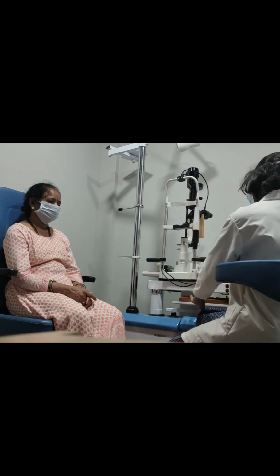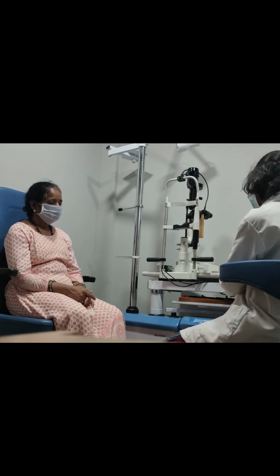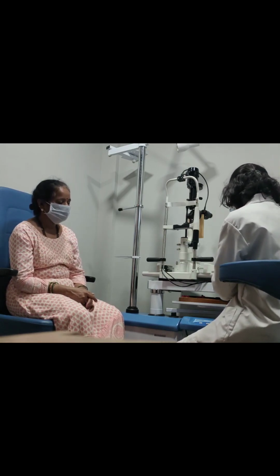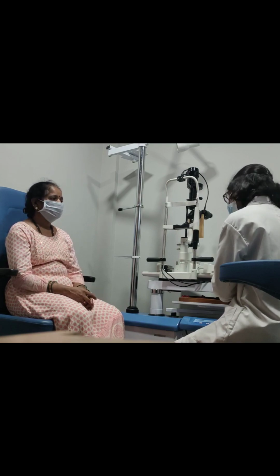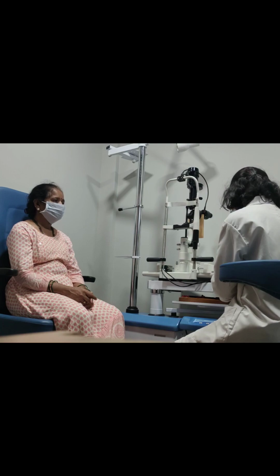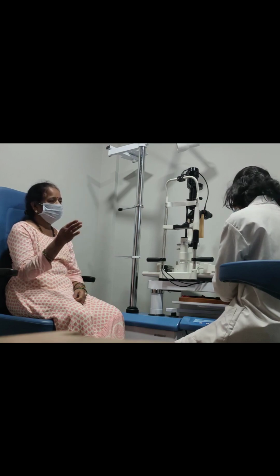Since my patient is a diabetic patient, I recommend she go for tinted glasses, because she must be having photophobia due to the proliferative diabetic retinopathy. I also suggested a Stand magnifier to read certain things. She said she is not much into reading, so I suggest the magnifier in case she wants to read anything.